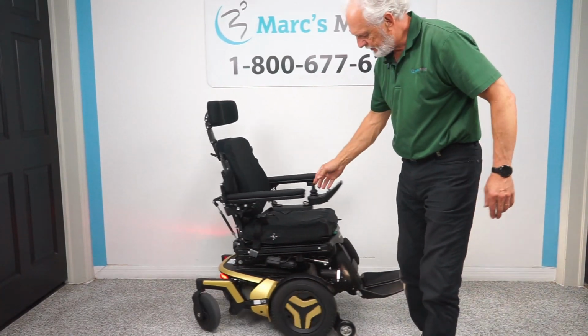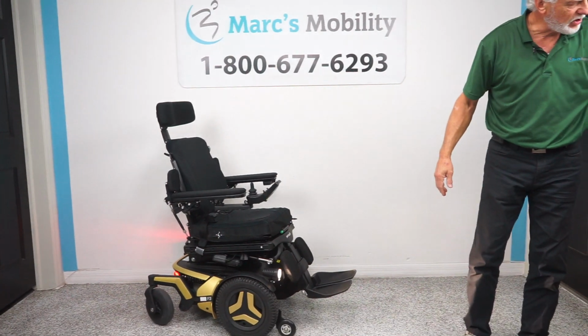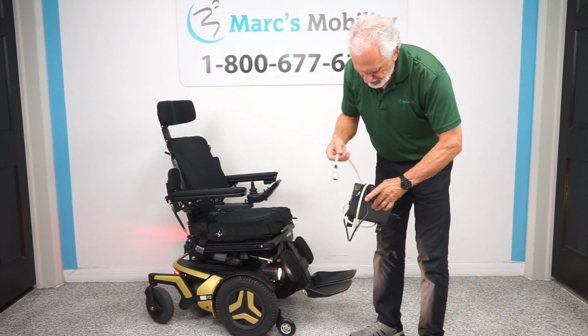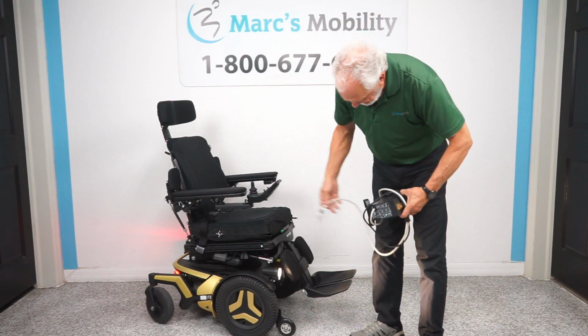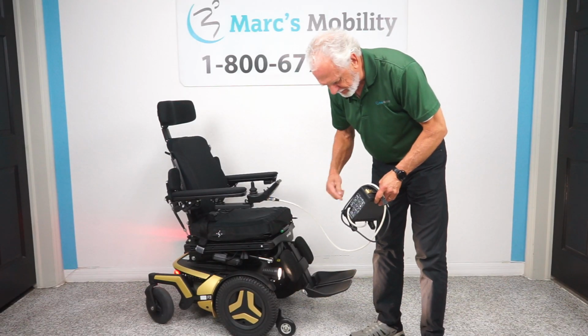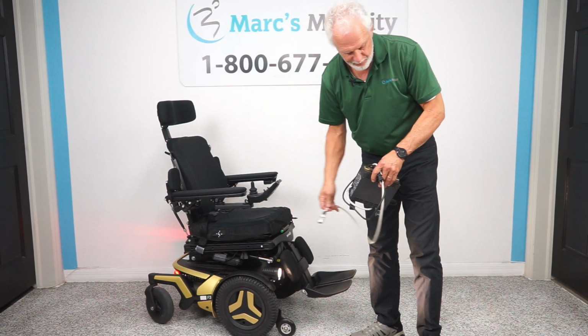When you charge the batteries in this chair, you'll use your Permobil charger. Now, this may not be the charger, but it is a Permobil charger. When you charge the chair, you plug it right here, right below the chair. And as soon as the light goes from orange, that is not a Permobil charger.